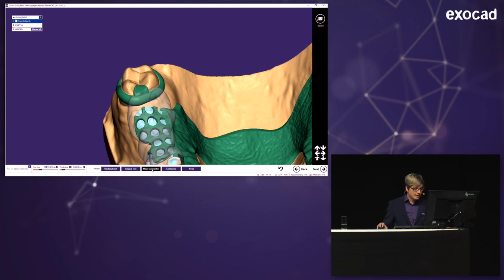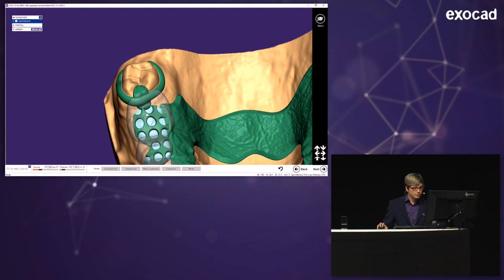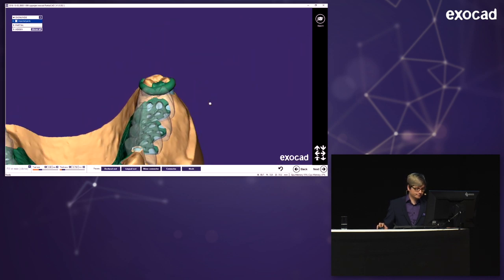And now I'm connecting the clasps to the retention mesh, the minor connector, just like that. I can also, as you see, just draw on the mesh itself. For that, there's also the preset mesh, which is exactly the same thickness. So here again.